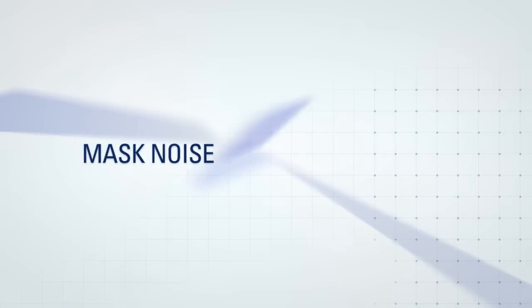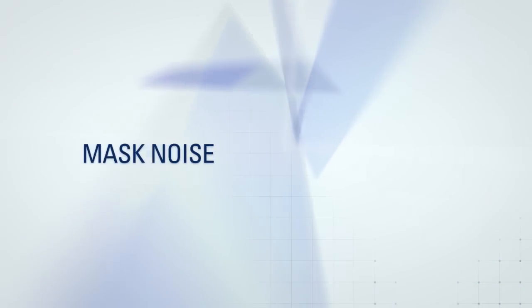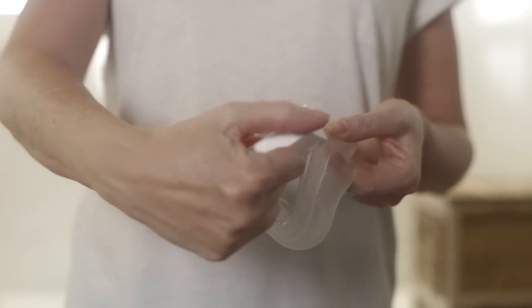Your mask is designed to operate quietly, so if it's noisy, the vents could be blocked. Clean with a soft bristle brush until the vent holes are clear.